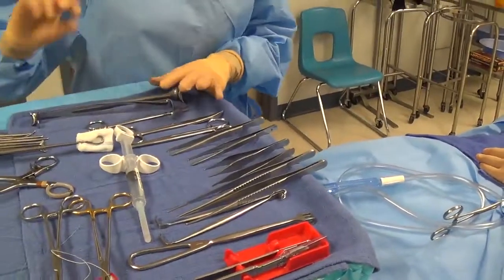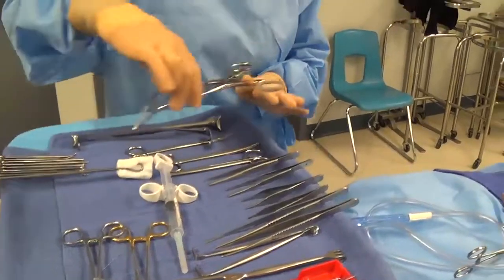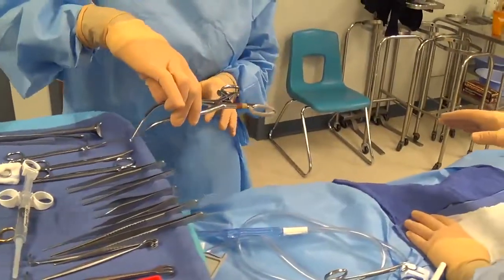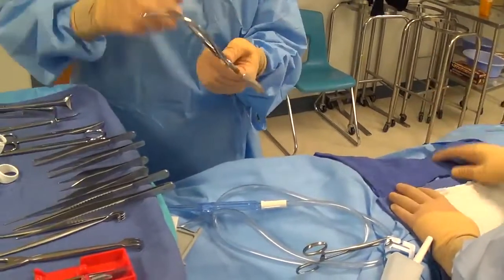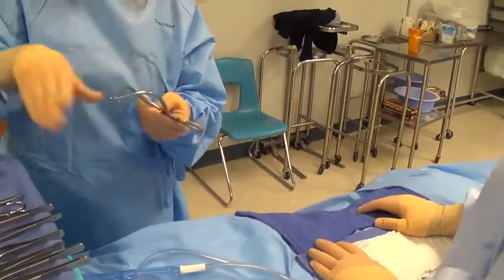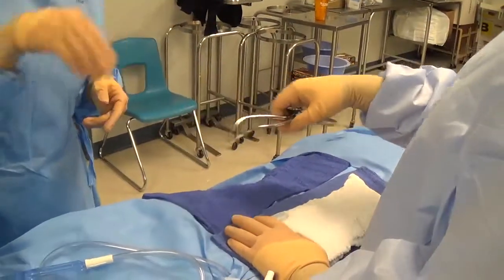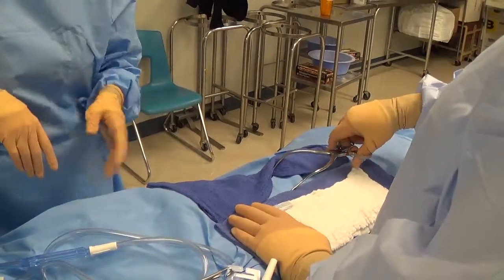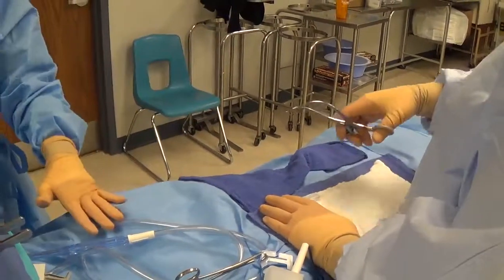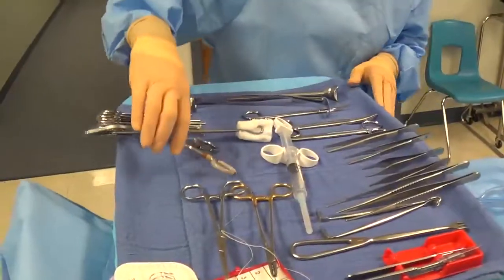If a retractor is sharp, use the same safety precautions as with a knife. For a sharp self-retaining Gelpi, make sure your fingers aren't rotated underneath — even though it has rings, don't hand it like a standard ringed instrument because you don't want your hand underneath that sharp item. Hold it on top, place it up at the field, and the surgeon will position it into the wound and open it. If it gets taken out of the wound and laid on the field, pick it up right away so it doesn't put a hole in the drapes.